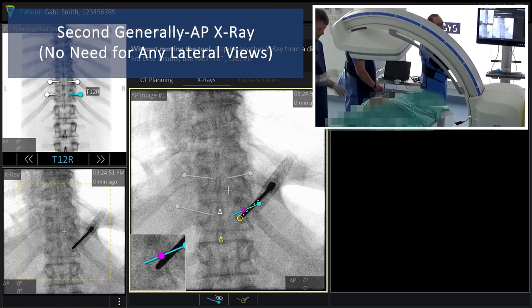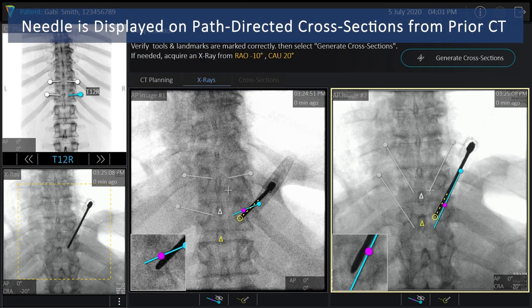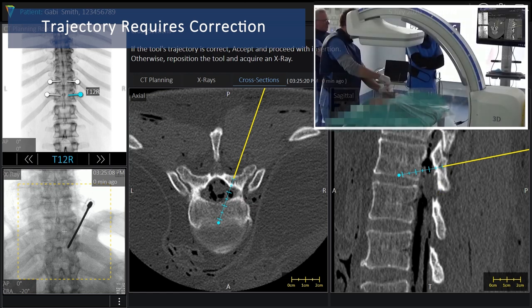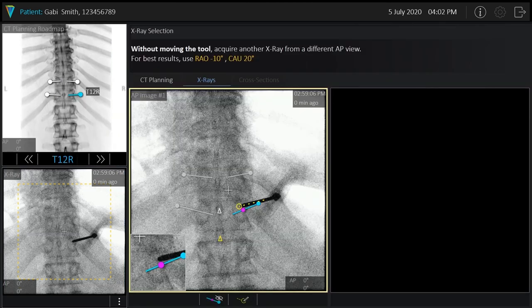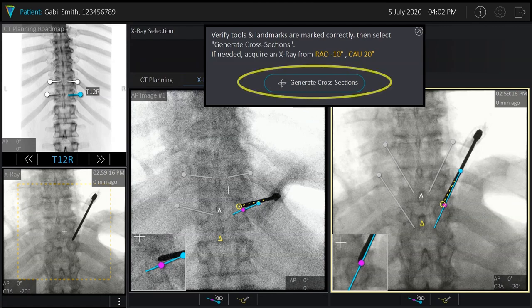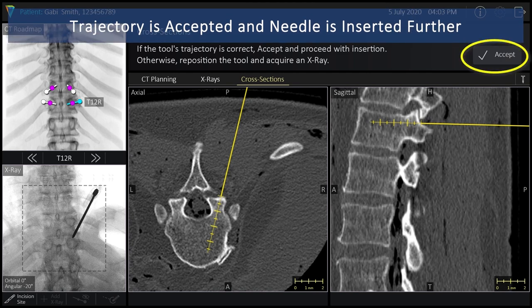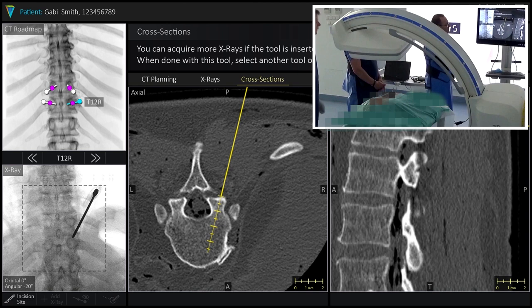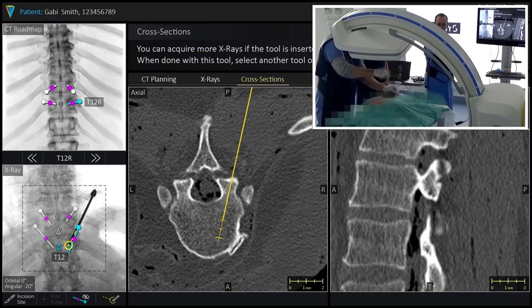You see the tool relative to planning, automatically projected on the x-ray image from the current viewing angle. Rotating the C-arm slightly and acquiring a second x-ray gives you 2D-to-3D co-registration and generates cross-sections. The cross-sections can show the trajectory is not optimal, in which case we correct it and regenerate. Once the trajectory is accepted, each subsequent x-ray automatically updates the depth. Notches show you how far you still have to go — like 10 millimeters — so it can be very efficient in terms of x-ray use.